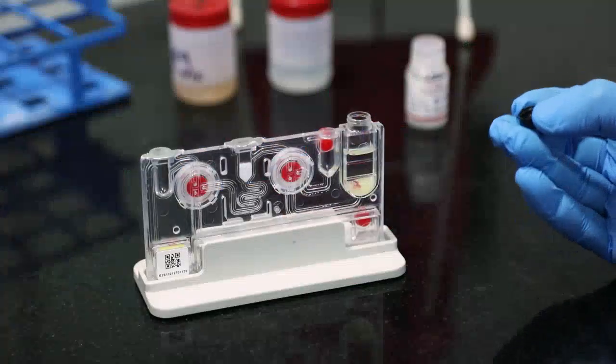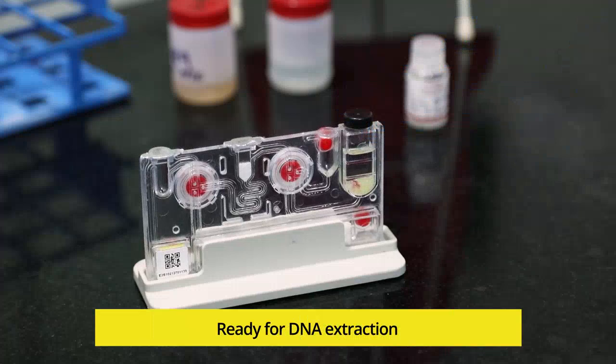Close the sample chamber of the cartridge. The sample is now ready to be processed in the TruePrep DNA extraction device.